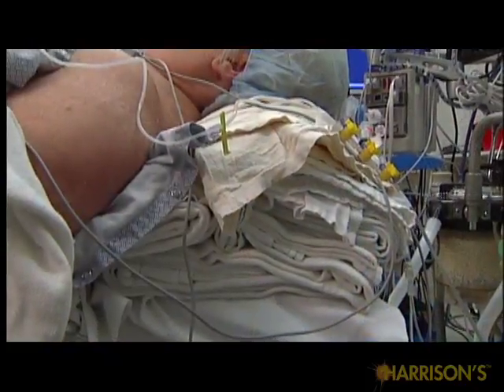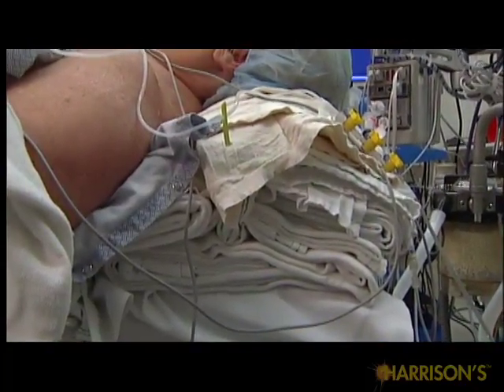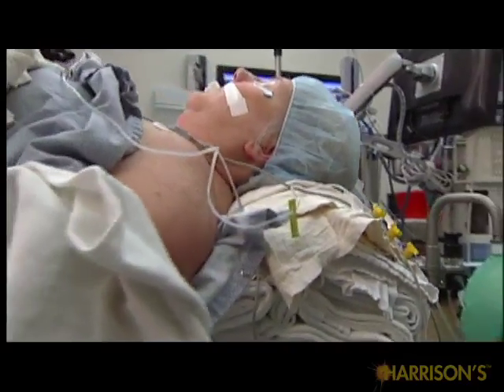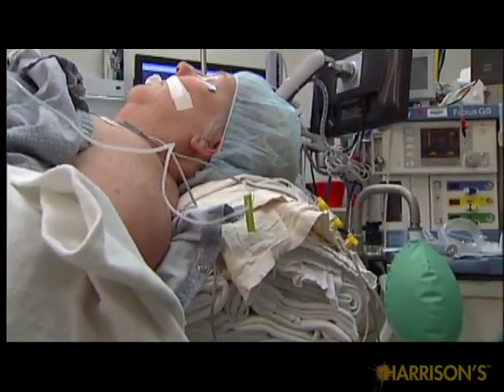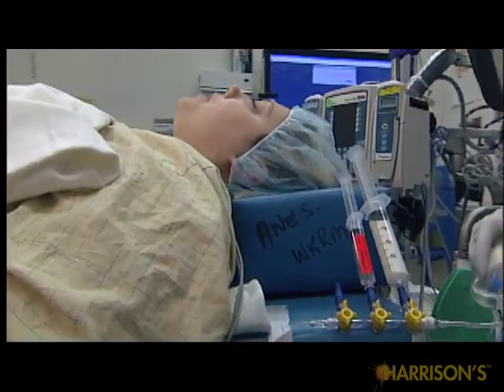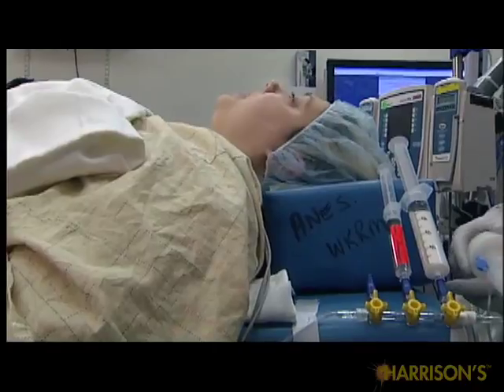This can be achieved by placing a blanket under the head to elevate the occiput approximately 10 centimeters, thereby flexing the neck, and by extension of the atlanto-occipital joint. A wedge-shaped pillow is useful to achieve the sniff position in morbidly obese patients.